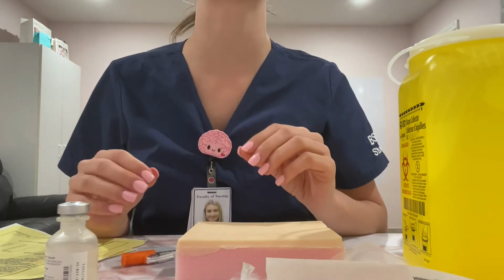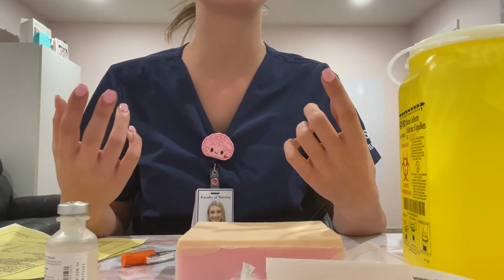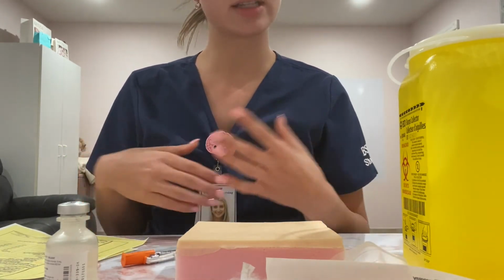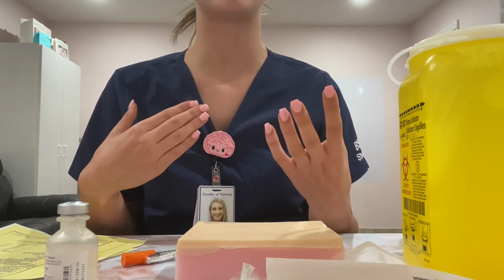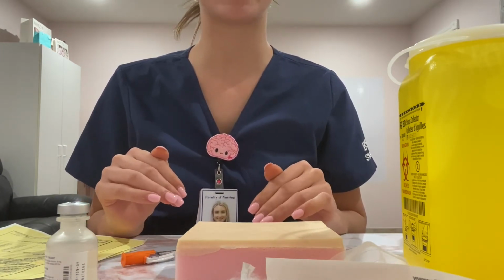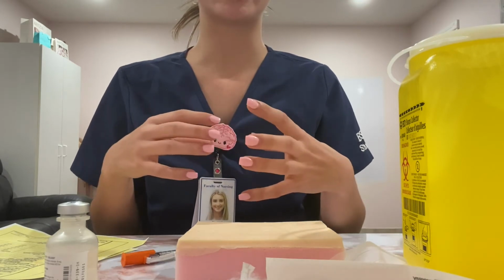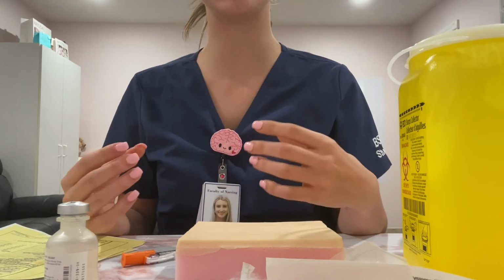And then before proceeding, I would inspect the site. And to do this, I would look for any bruising, inflammation, edema, or any signs and symptoms of infection. And if I saw this in the site, I would not inject into that site and choose another site that didn't have any of those signs. And then I would palpate for a mass or tenderness, and I'd look for lipohypertrophy, which is like a lump underneath the skin, excessive fat under the area through injecting the subcutaneous insulin too often.